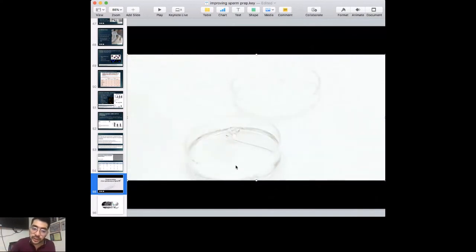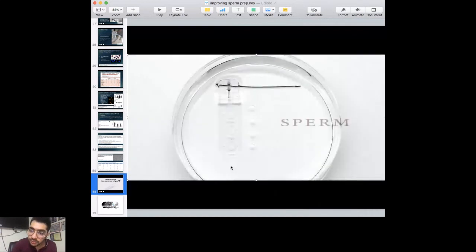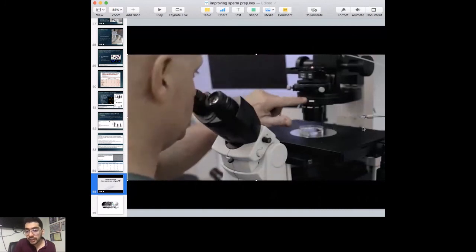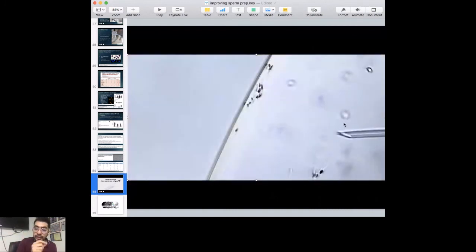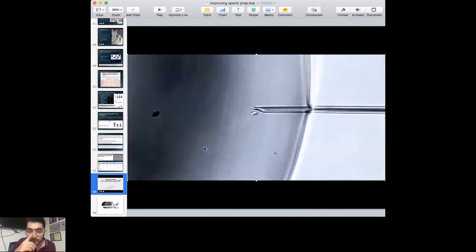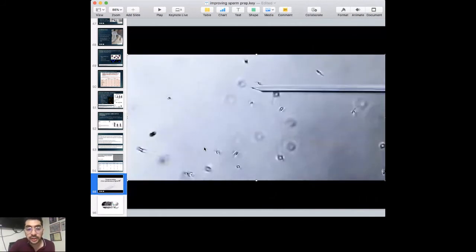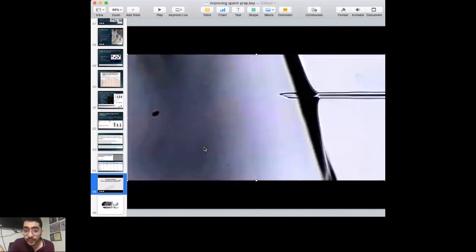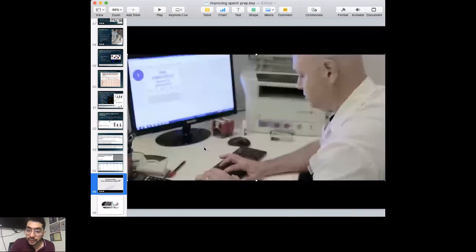And then you just put it into your dish, which was containing the sperm wash media as well. So sperm wash media, you load the sperm into the wash media. And from here, you can actually pick up the sperm using your micromanipulator and load it directly to the device, right? So this is just an example where Michael is one of the guys who does a lot of work here. So he is basically picking up sperms from the wash droplet, loading it into the sperm freezing media, which we've created into that device, right?